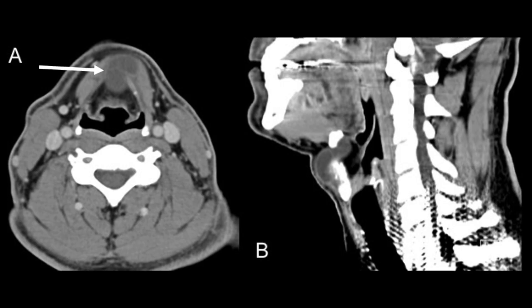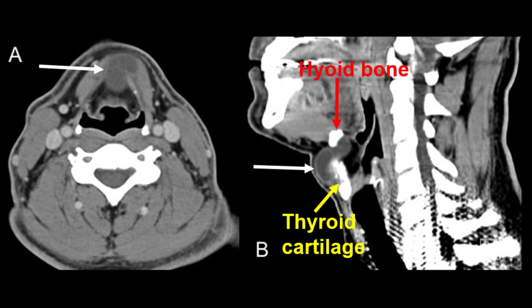On the left side of the screen we have axial CT images. Here you can see a well-defined lobulated hypodense lesion indicated by the arrow. There is no peripheral enhancement after contrast administration, confirming its cystic appearance. Let's now look at the sagittal reconstructions on the right. We can clearly identify the lesion located just inferior to the hyoid bone.